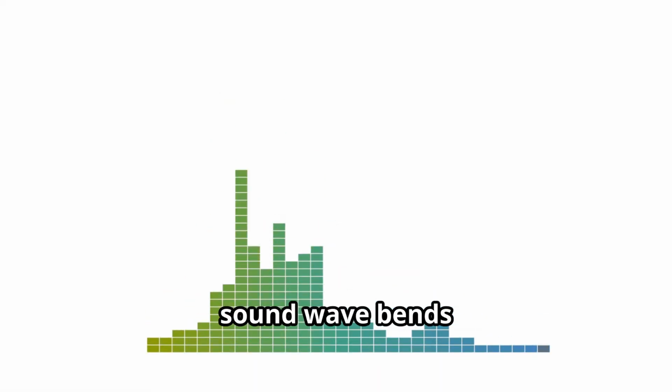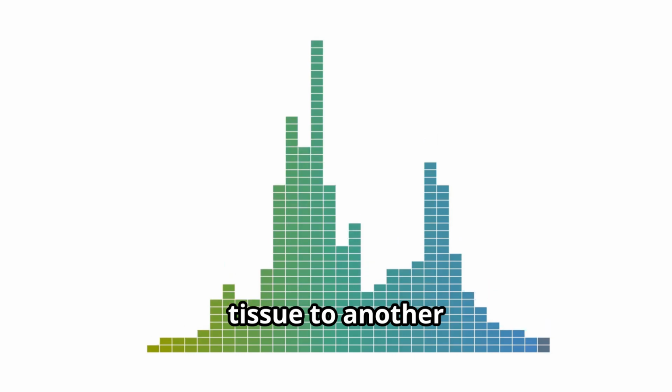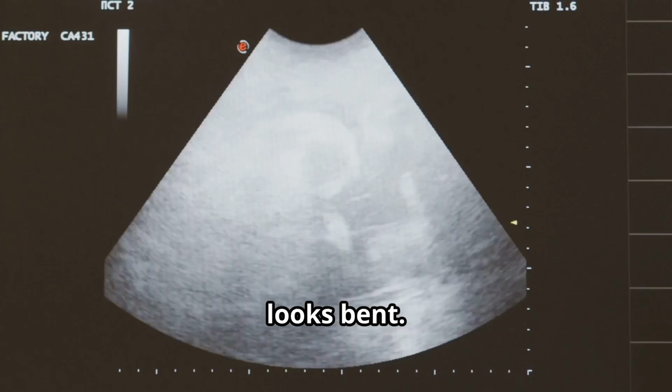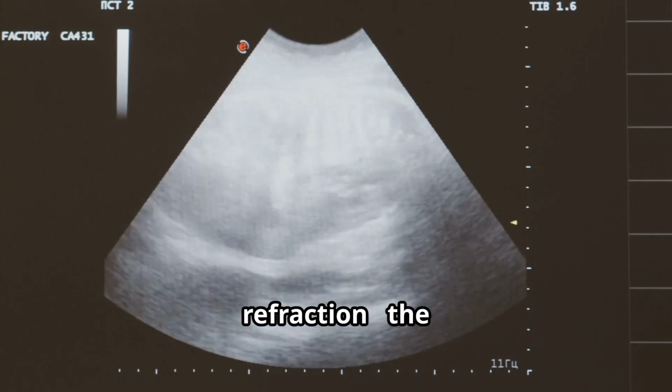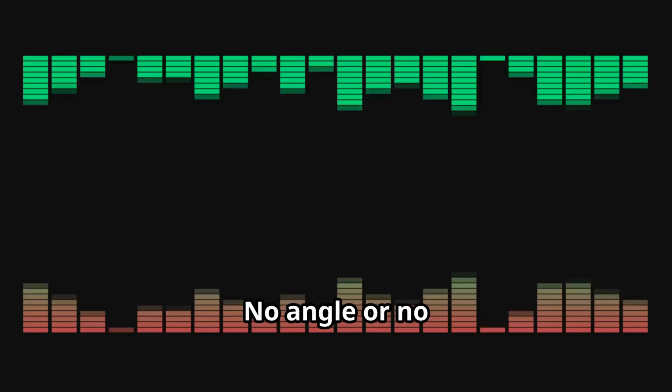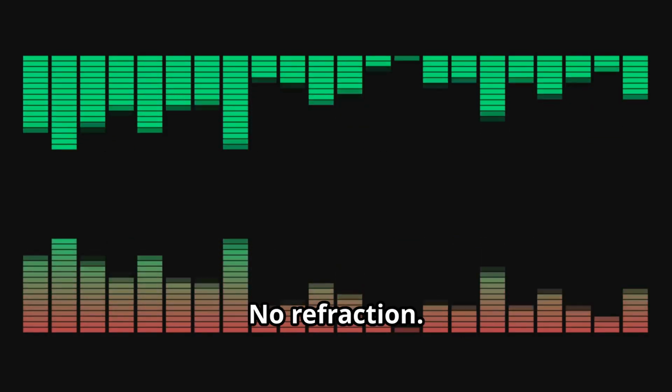This happens when a sound wave bends, passing from one tissue to another with different speeds. Like a straw in a glass of water, it looks bent. Two things are needed for refraction. The wave must hit at an angle and the tissues must carry sound at different speeds. No angle or no speed difference, no refraction.